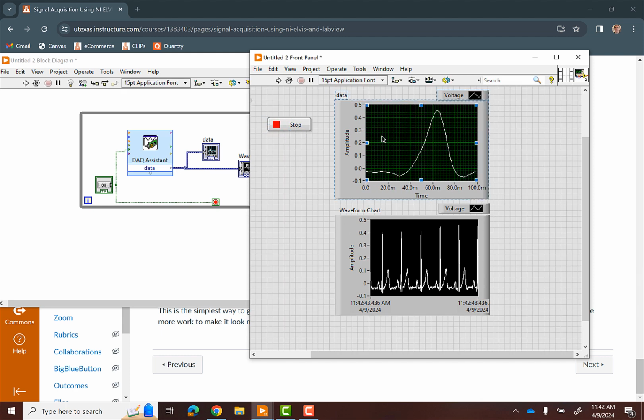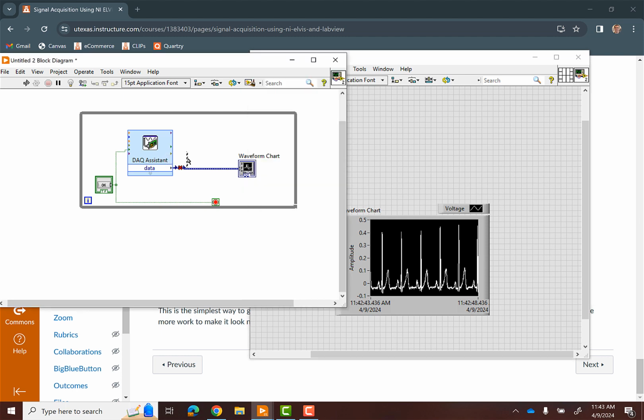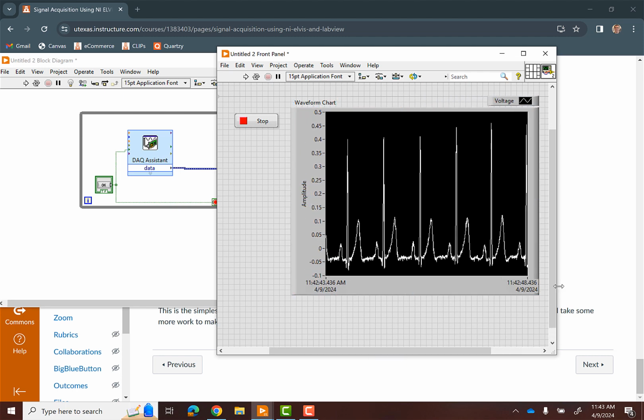So now I'm gonna go ahead and I'm gonna just delete this graph because we don't want that anymore. You do have to make sure you clean up loose wires or else it won't let you run. So I'm gonna click on that and delete these loose wires. And then it's just a matter of making this look good, right? And making it look how you want it to look. So I'm gonna, you know, make it nice and big so we can see.